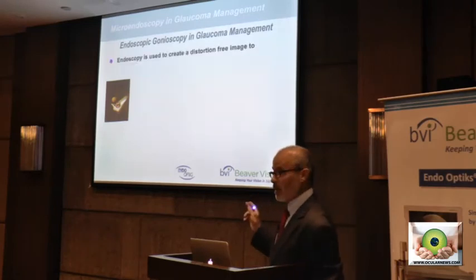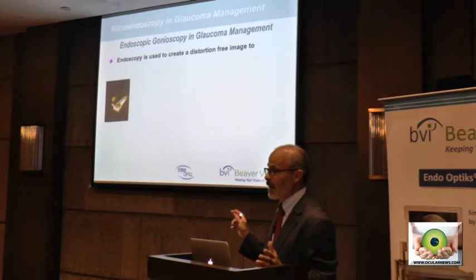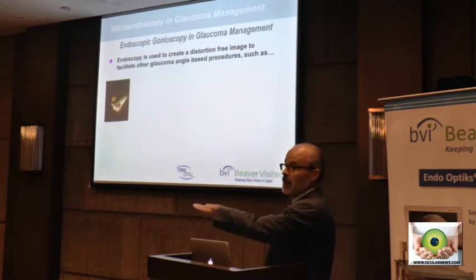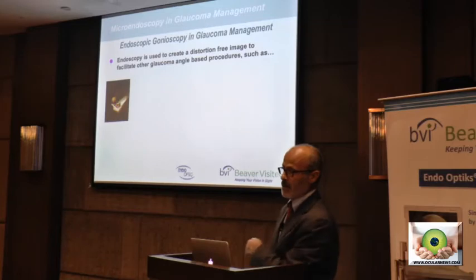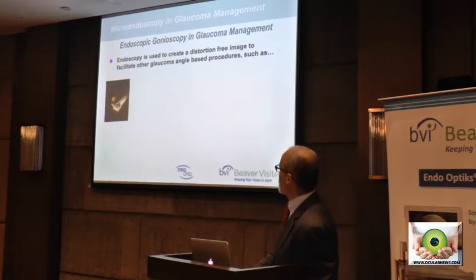He just did a follow-up study at the American Glaucoma Society about 2 weeks ago now, and I don't have the follow-up slides, but the effect was protracted. I think he was reporting now of 44 months with similar IOP reduction and reduction in medication.